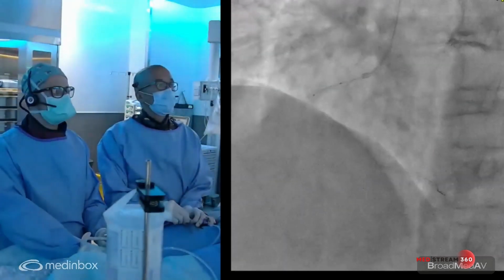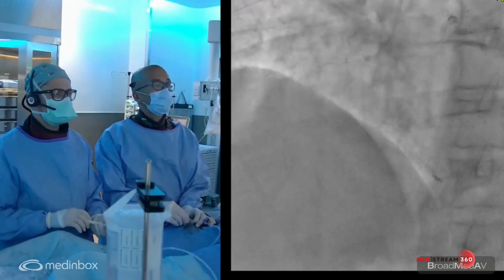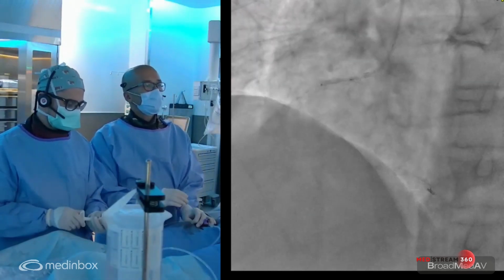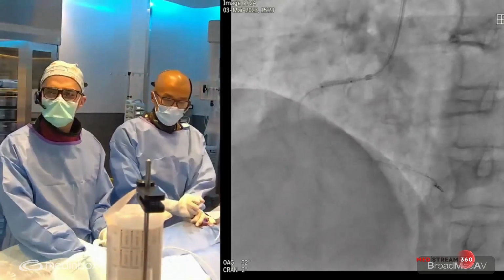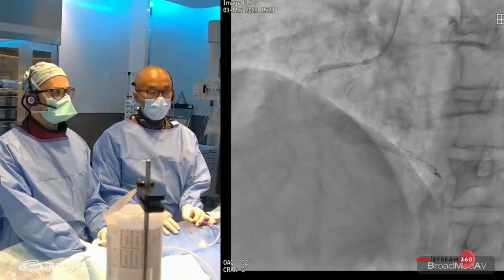The patient is having chest pain at the moment because of the shockwave and the prolonged inflation. So this is expected in this type of therapy. This is actually a good sign. It means we're treating the physiology, and the clinic is on the side of us intervening. We're at 12 atmospheres. So usually we talk about doing IVL.